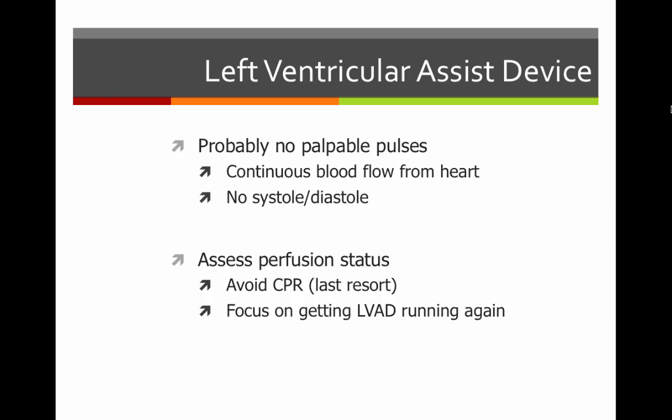What cardiologists really advise against is CPR, using that as a last resort in our patients. So if we can't get anything working, can't get anything done, then we can do CPR. So CPR should be kind of a last resort. If we start doing mechanical CPR in these patients, we are bound to displace the device itself, and that's going to lead just to poor outcomes. So we need to leave the device in place, minimize any mechanical CPR on our parts that might displace it, and focus on getting the LVAD up and running again.